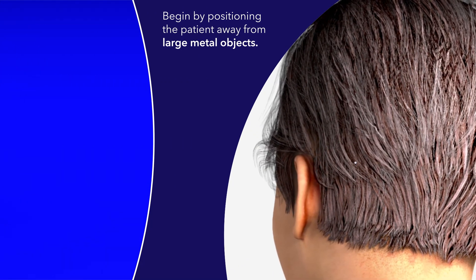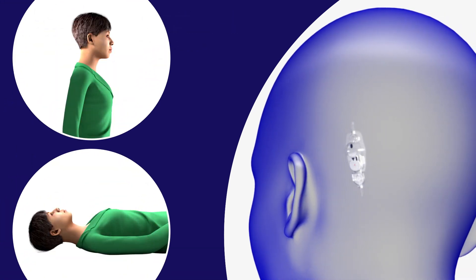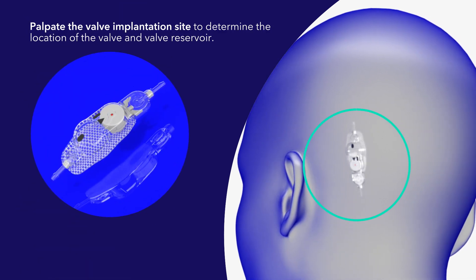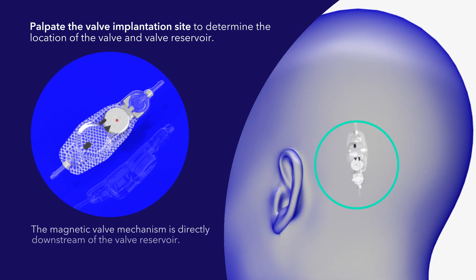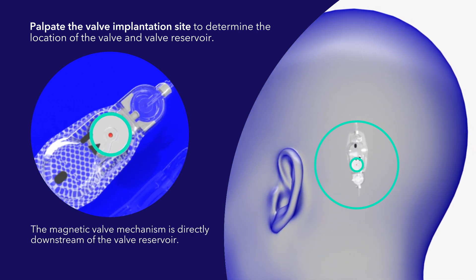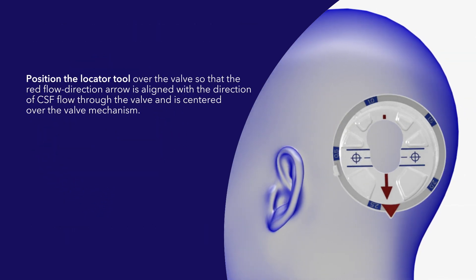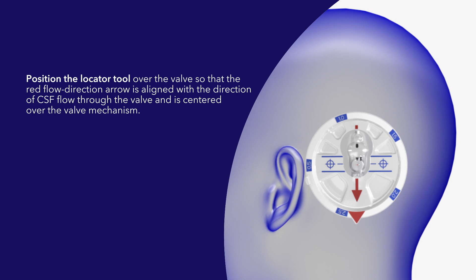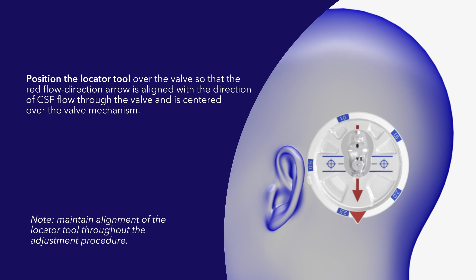Begin by positioning the patient away from large metal objects. The patient may be in the upright or supine position. Palpate the valve implantation site to determine the location of the valve and valve reservoir. The magnetic valve mechanism is directly downstream of the valve reservoir. Position the locator tool over the valve so that the red flow direction arrow is aligned with the direction of CSF flow through the valve and is centered over the valve mechanism. Maintain alignment of the locator tool throughout the adjustment procedure.